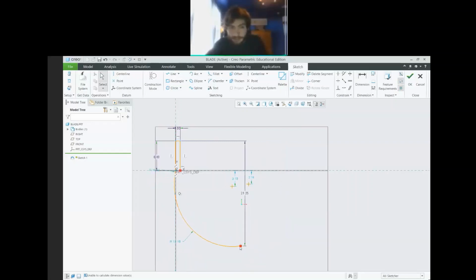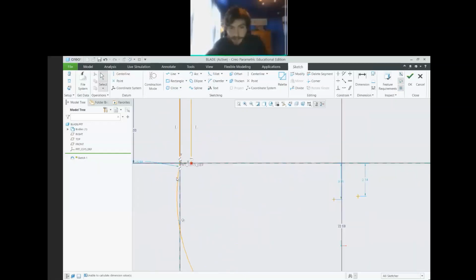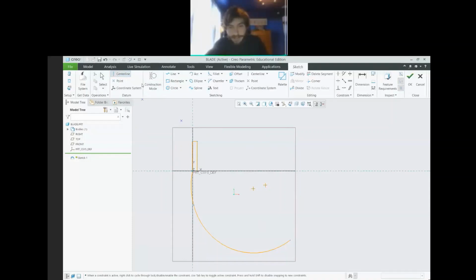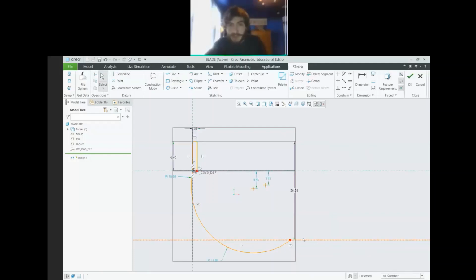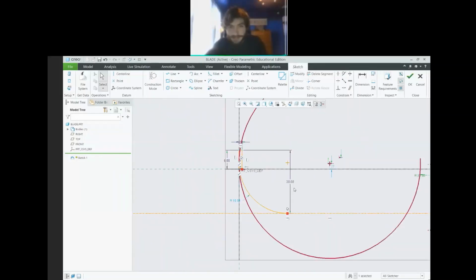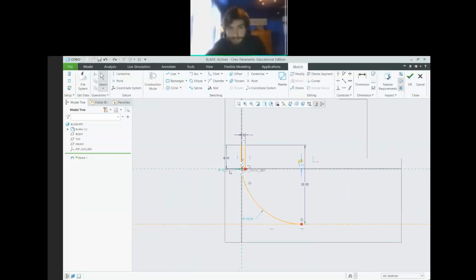The other thing that's important is that this needs to be the lowest point on the blade. So what we'll do is create a center line here, horizontal at the end of this. Once we have that horizontal center line 20 inches from our top, we can go to our constraints, and we have the tangent constraint. We can click this curve and this line, and make them tangent to each other. Now this looks more like how we expect this to look.